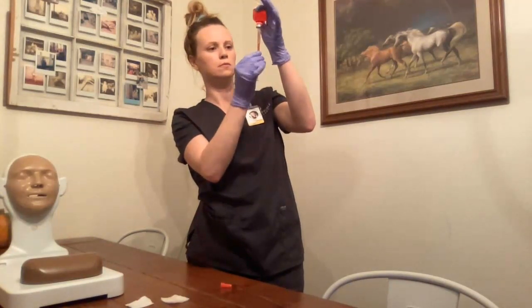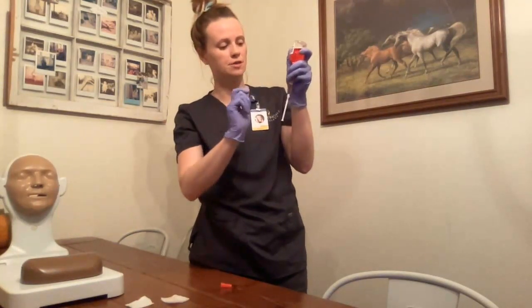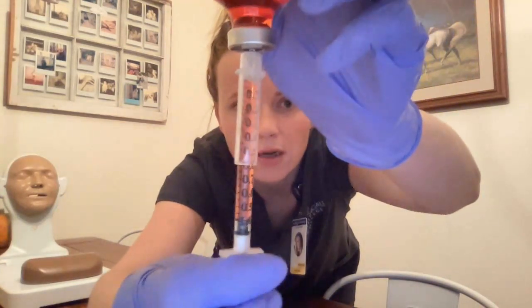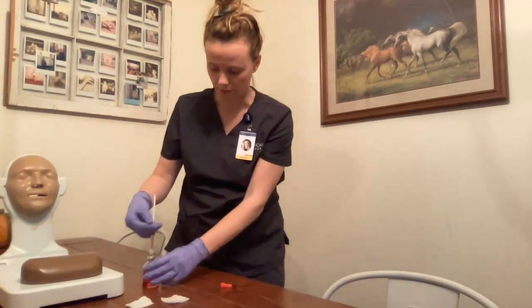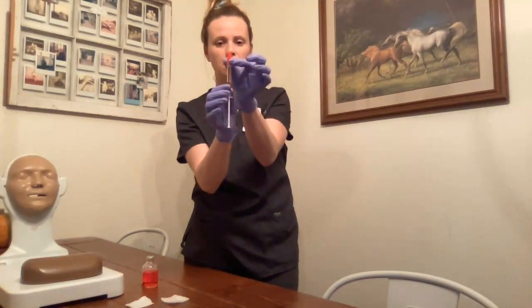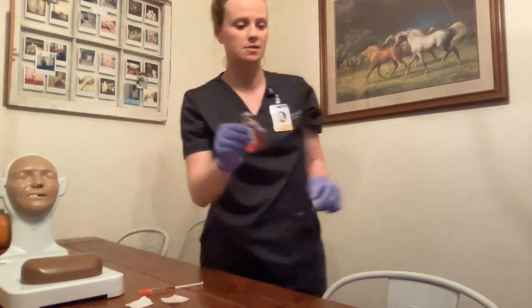There are no air bubbles, but we need to make sure when drawing solution into a syringe that air bubbles aren't present. If they happen to be, you can either tap it or in some cases fully inject the medication back into the vial and then withdraw again. There are no bubbles. I have to recap the needle — typically you're not supposed to do that, but in this case I have to — so I would use the scoop method. Just scoop the cap on top and recap. The medication is ready for use: one milliliter. I'm going to put my vial aside since I'm finished with it.